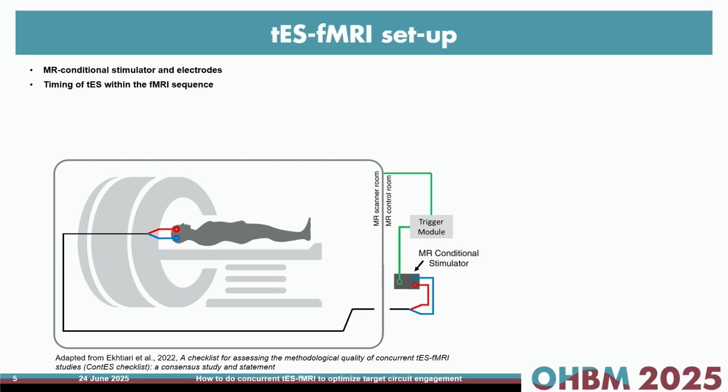And as many of you probably know, the MR room works as a Faraday cage, keeping radio frequency signals coming from the outside from coming inside, because what we're trying to measure in MRI is also radio frequency signals, which are extremely weak. So having something coming from the outside would disturb our measurements.